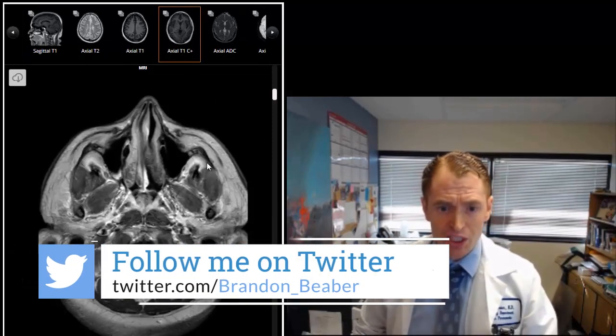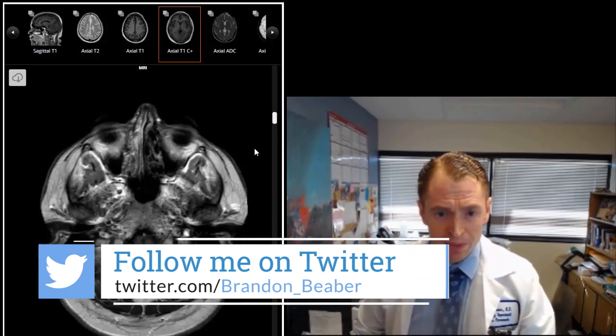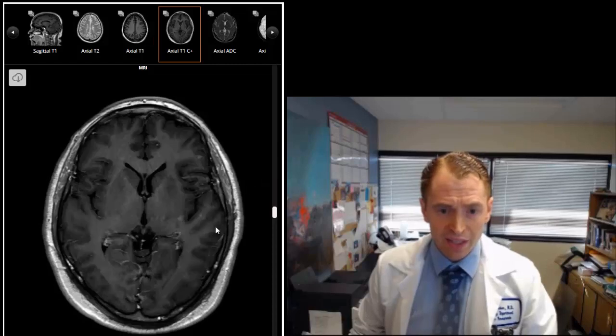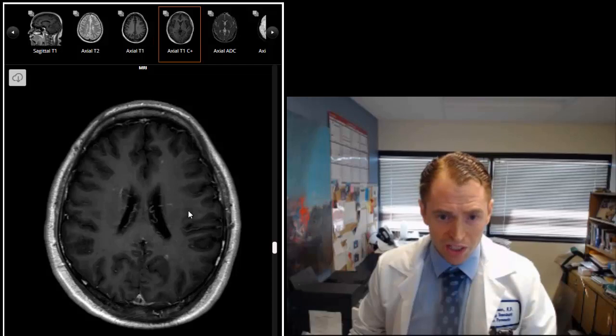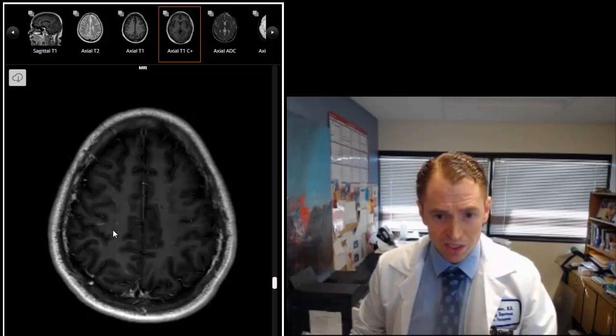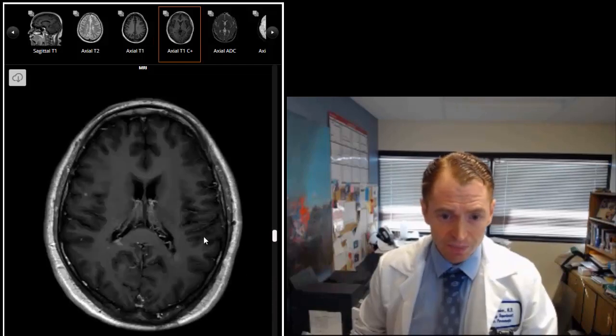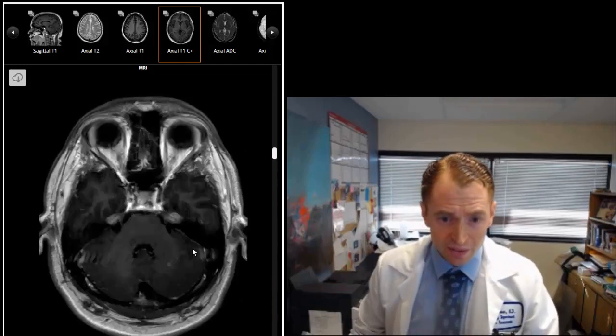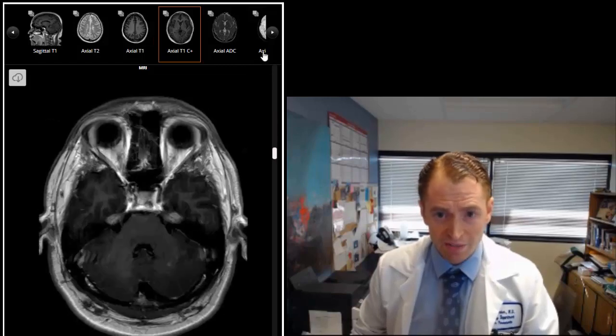Now here we can see the images with contrast. This is a T1 image with gadolinium dye. Here you can see that a lot of the lesions take up the dye. So you can see all these spots. This man has numerous contrast enhancing lesions. And you can see this one in the cerebellum for instance. So there are a lot of enhancing lesions.